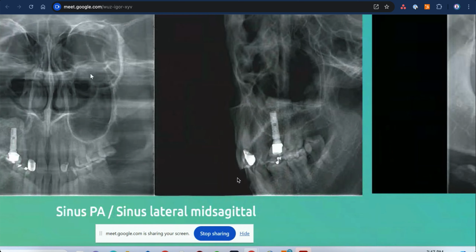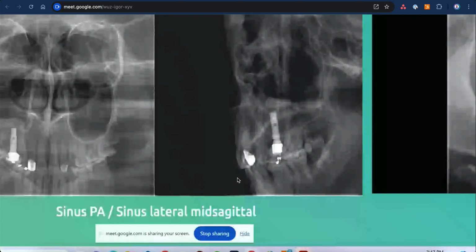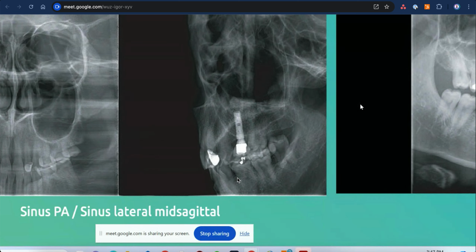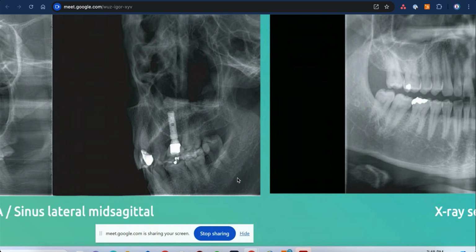Now this is the other one. This is the sinus view, the sinus posterior anterior. Like the same thing I can see you here, this is the face I can see now. But this is the profile of your face, the side of your face. When you look to the right or left, for example when you pray, like when you say Assalamu alaikum wa rahmatullahi wa barakatuh and turn your face, I can get this view. So this is from the side, not just from the front of the face.